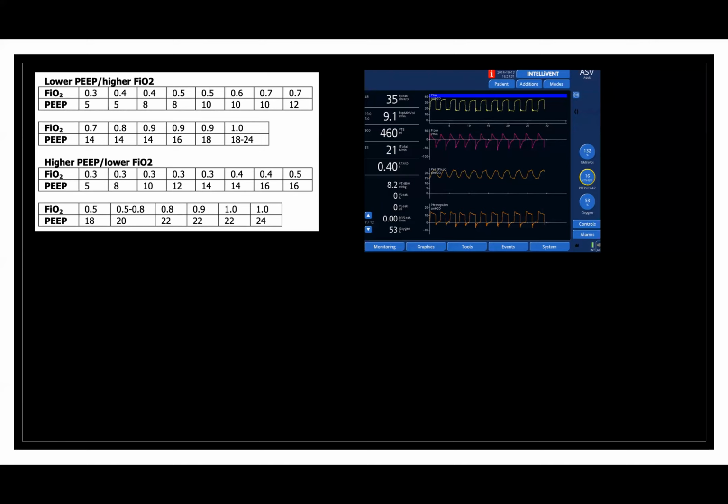This is a screenshot from our Hamilton ventilators. And you can see that when we insert the esophageal balloon, we get an esophageal pressure. And many of you have probably done this, where you watch for end expiration and try and target a slightly positive transpulmonary pressure. And that tells you that you might not have the right PEEP for every alveolus, but you're ensuring that at the end of expiration, the lungs are not being pushed and compressed by the pleura, that they're open, the airway pressure is higher than the pleural.